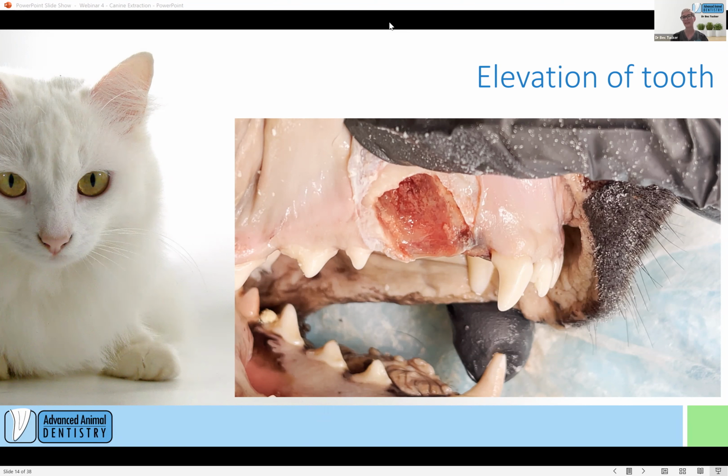In our hands, even with fairly advanced tooth resorption in maxillary canine teeth specifically, mandibular is a totally different story, we'll always attempt to take the whole tooth out, and you'd be pretty shocked about how much tooth actually comes out. Some of them look like absolute ghost roots with very similar density to the surrounding bone, and you'll still almost always get an intact root out.